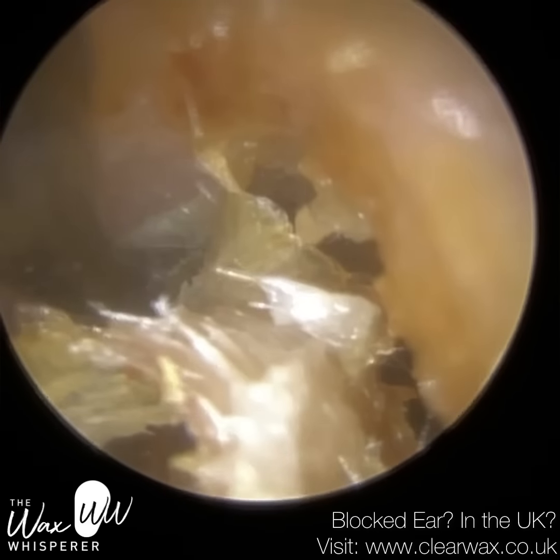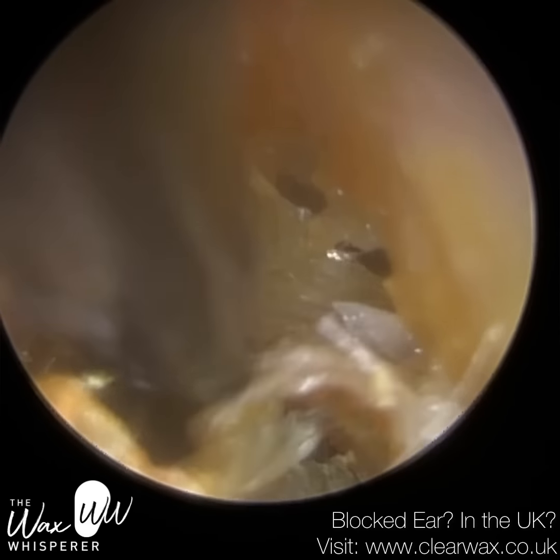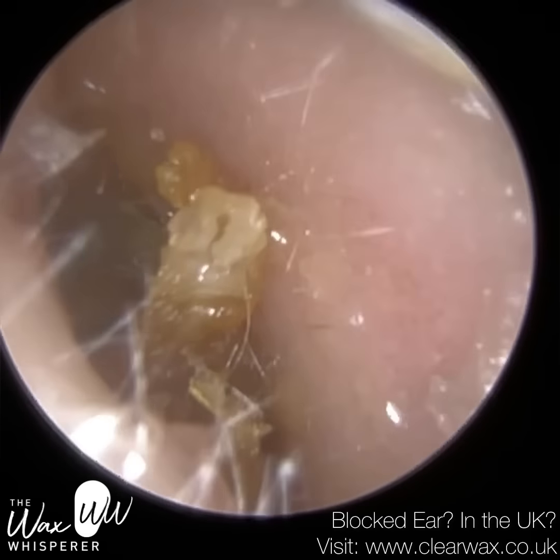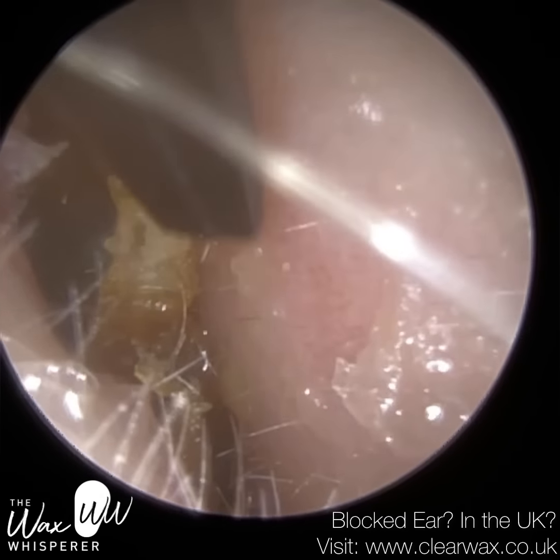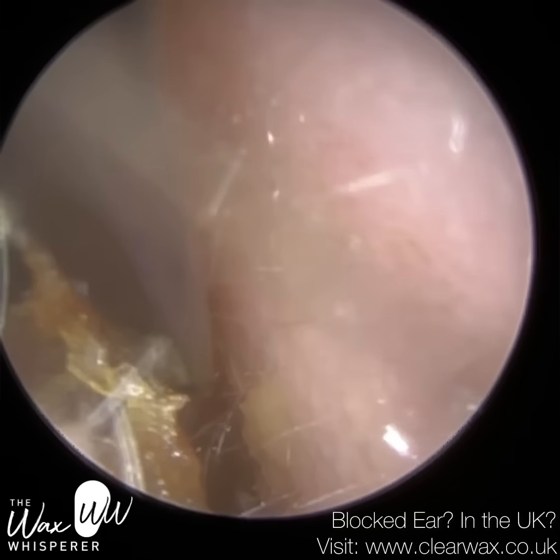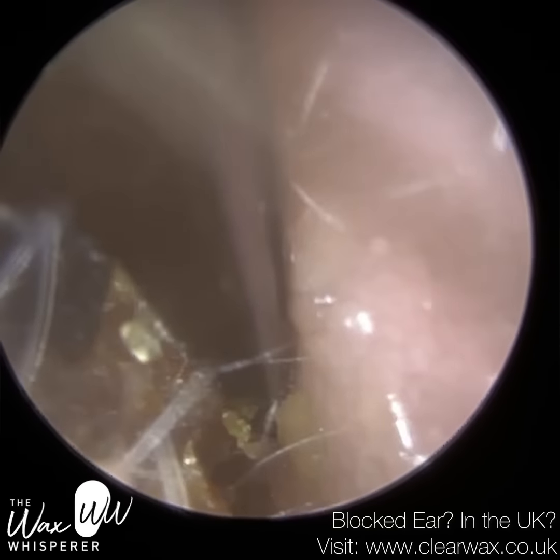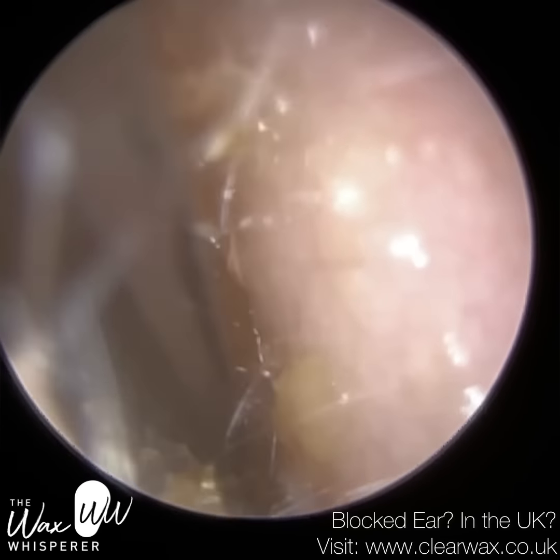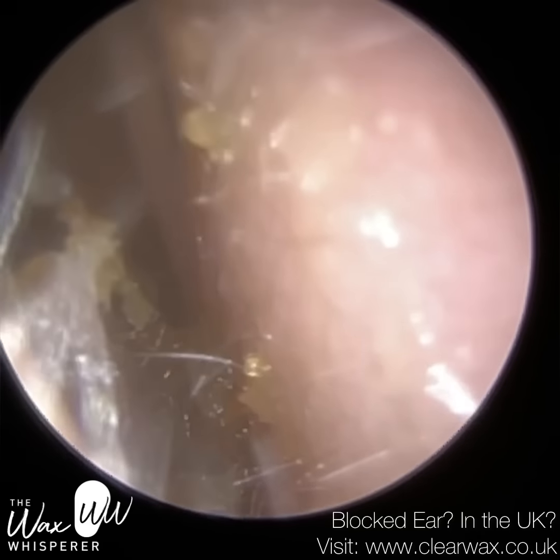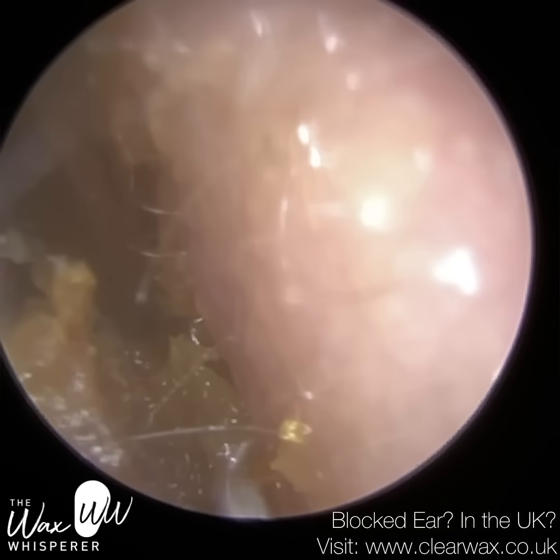So the eardrum itself, when you're looking at it via the entrance of the ear canal, is concave, conical in shape. The center bit is pushed inwards, and also the eardrum is obliquely orientated. So in the case of the right ear here, the top left section of the eardrum is closer to us than the bottom right section, which is positioned deeper in the ear.